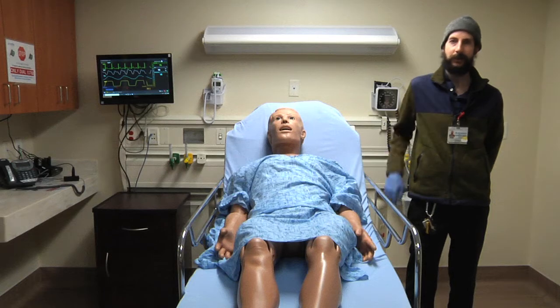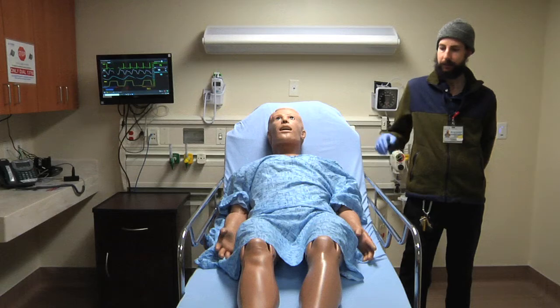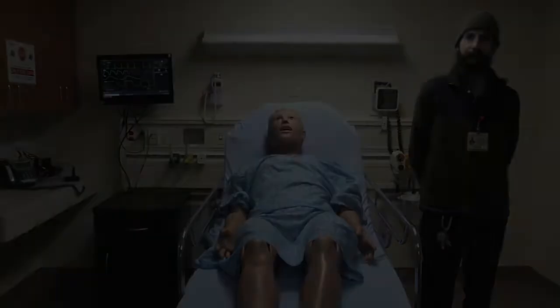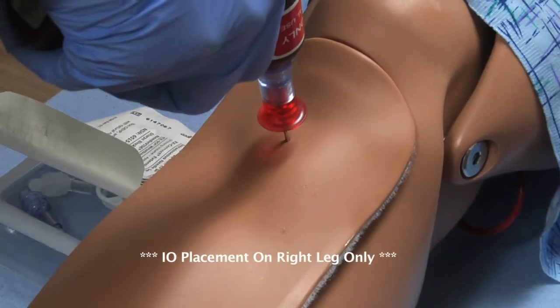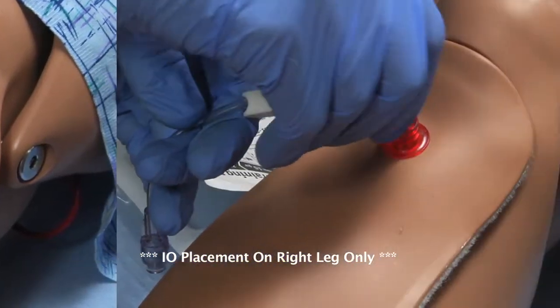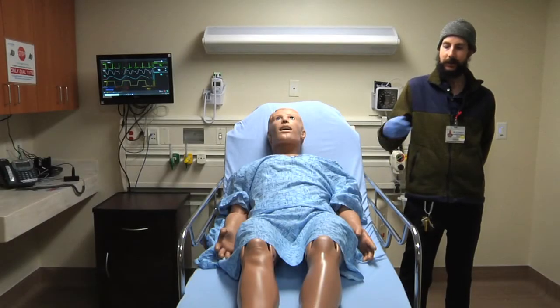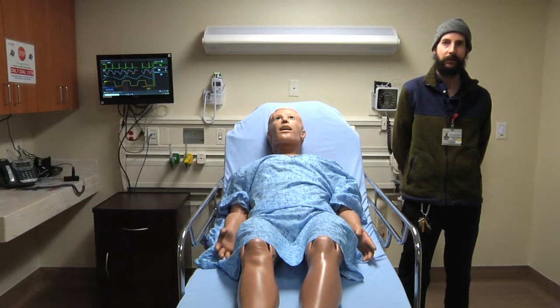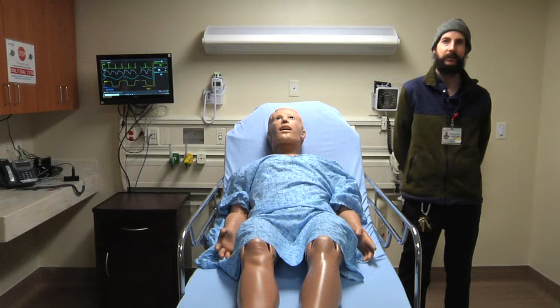So you can also administer IVs on our patients down here in the Sim Center. But we please ask you to not push any fluids of any kind. So in an emergency situation, you can also place IOs. Any medications to be administered will be provided for you by the Sim Center. If you are to administer medications, please name the drug and the dosage you were given.